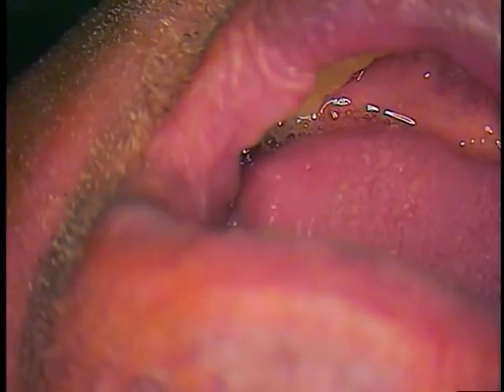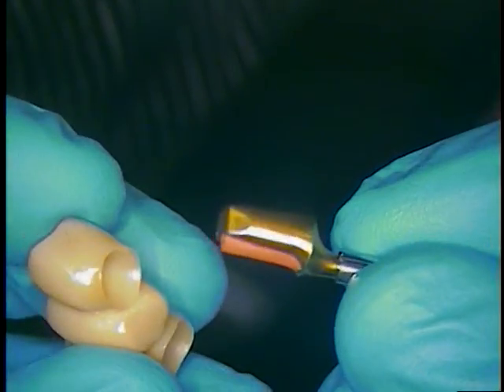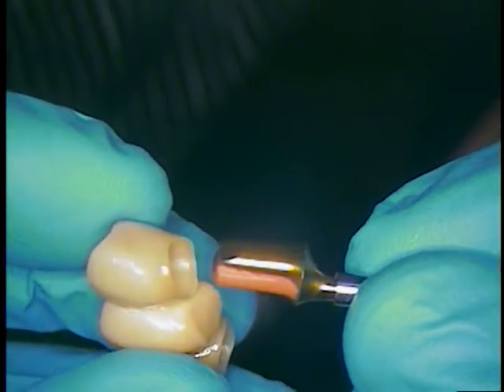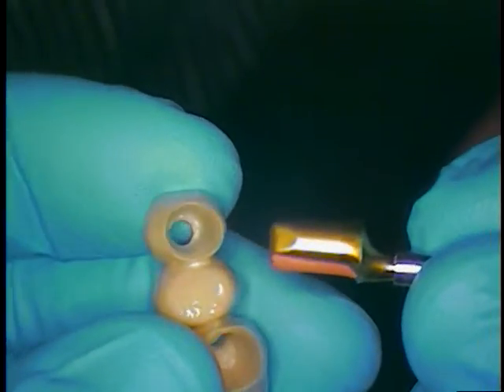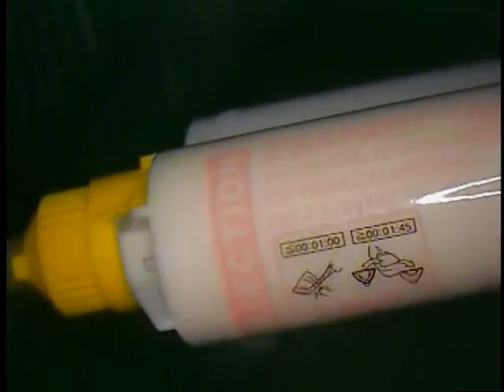We're trying our abutments. To do that, we use a special jig that was made. But before I even do that, I'm going to show you what I did with one of the implants. When we go to cement these into the bridge itself and we do it by hand, we line everything up on the model just to make sure that things line up both on the model and in the mouth. This is our block-out material — we use this material from GC. It's called the NDS. It sets very fast — quick setting.